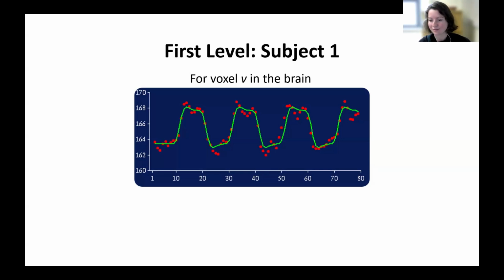In this experiment, there was a rest period during which no stimulus was shown, followed by the presentation of a visual stimulus, and followed by another rest period, another stimulus, and so on and so forth. So these are likely data from somewhere in the visual cortex, where you can clearly see this periodic response to every visual stimulation. And this is also why the GLM fits so well, because the brain response in this specific context is pretty simple. With more complicated experiments and designs, the data will likely look more complicated as well, and it might be harder for the GLM to fit the data.